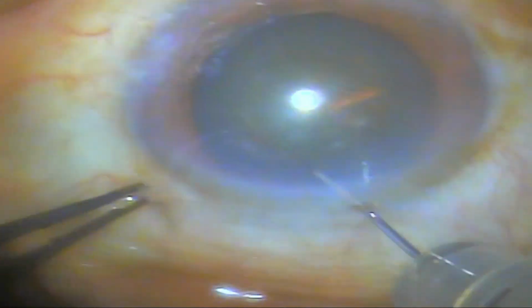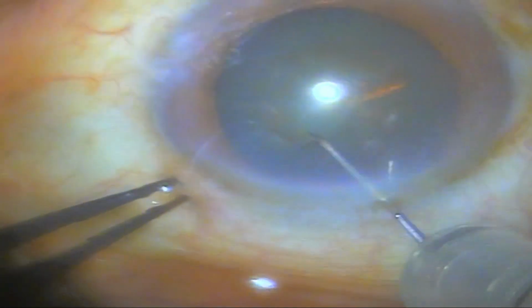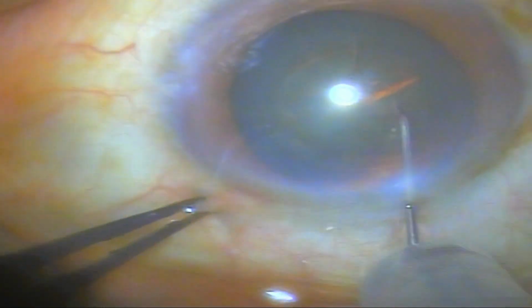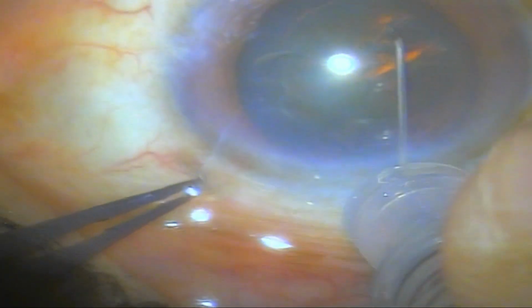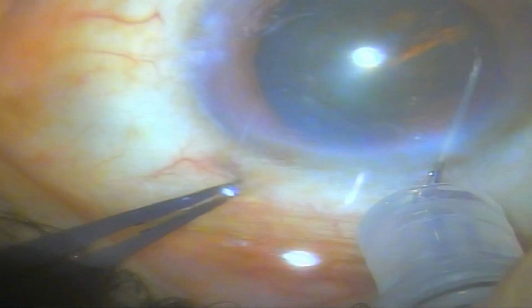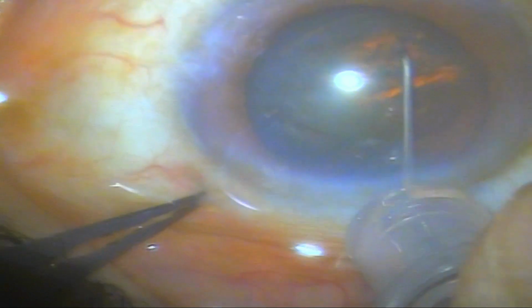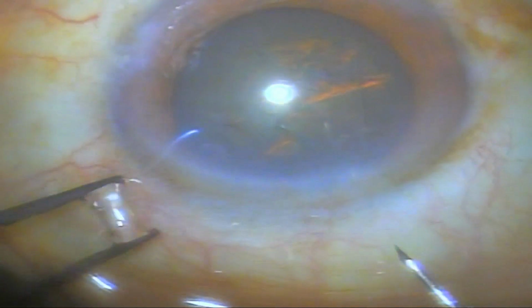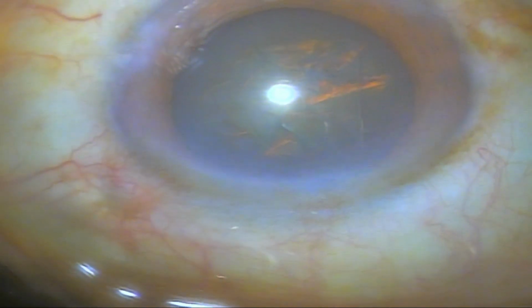As we are done with the capsulorrhexis and when we remove the cystotome, there will be a small gush of aqueous from inside the anterior chamber towards the cystotome port, which will immediately push the anterior capsule, and the anterior capsule will plug the cystotome port, and then there will be no more drainage of aqueous from inside the eye. The anterior chamber is quite well formed, deep and adequate. Intraocular pressure is normal, and as you see, there is a gush of aqueous coming out through the port, and the anterior capsule is plugged, engaged into the cystotome port.